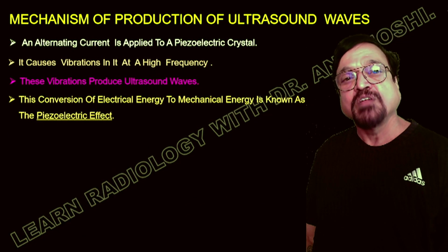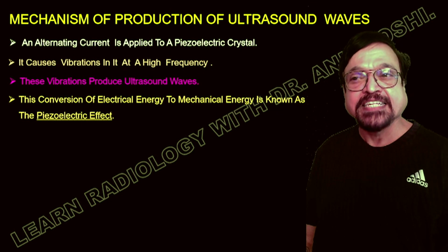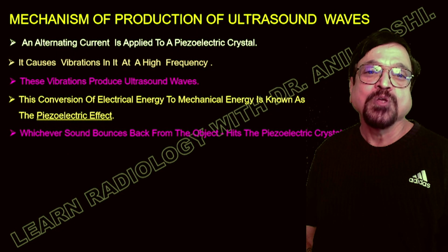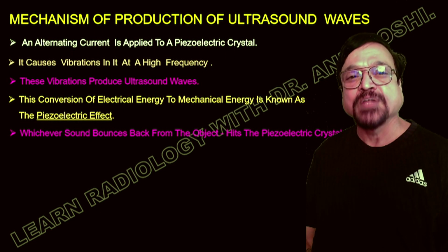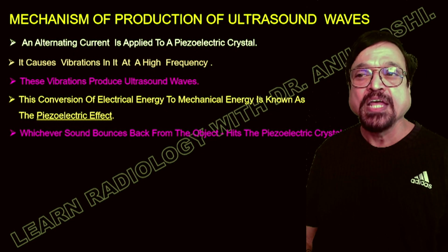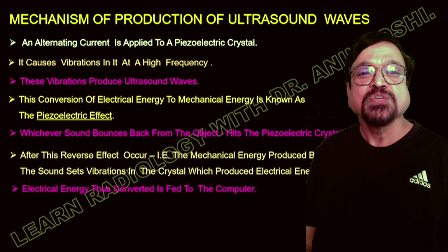These ultrasound waves travel through the body and come back to the crystal, and depending on the waves coming back, they produce the signal. First is the piezoelectric effect, conversion of electric energy into ultrasound energy. Second is the reverse piezoelectric effect, that is, conversion of ultrasound waves into electric energy. So that's how the ultrasound physics works.